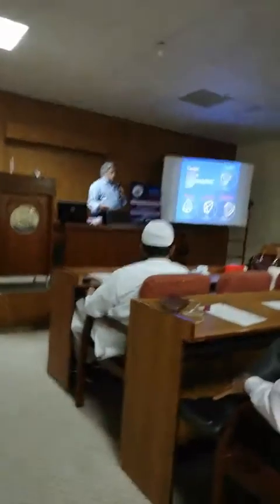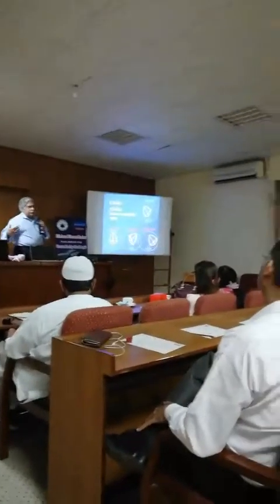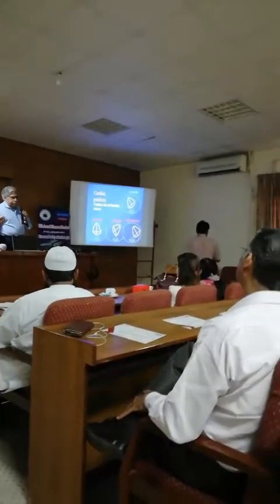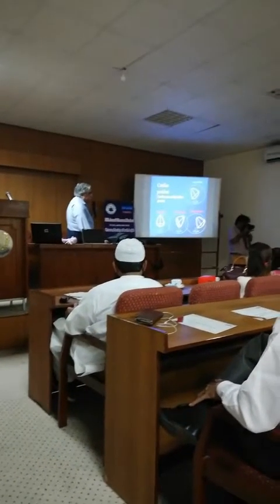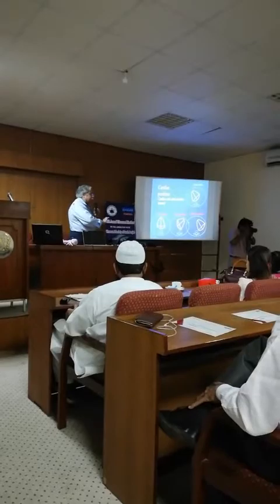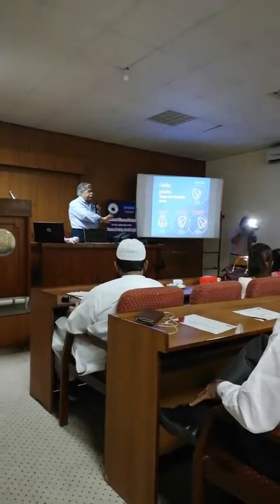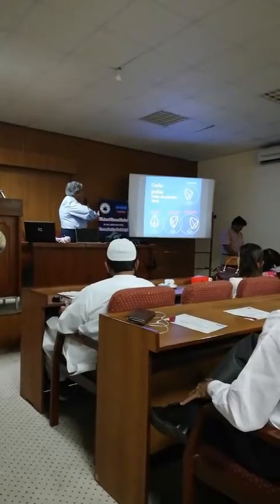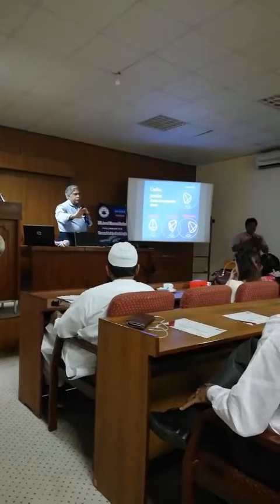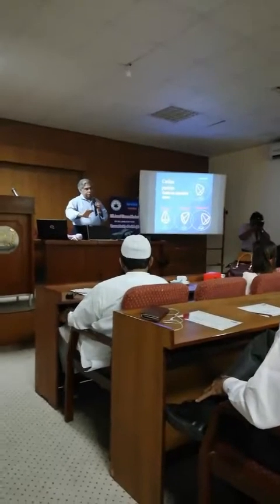This is called mesocardia. Of course, dextrocardia, everybody is familiar with this term, when the apex is pointed to the right. But remember, the bulk of the heart is normal, it's in the midline. If the heart is pointed to the left, but the whole heart is pushed to the right side, then that is not dextrocardia, but that is dextroposition.